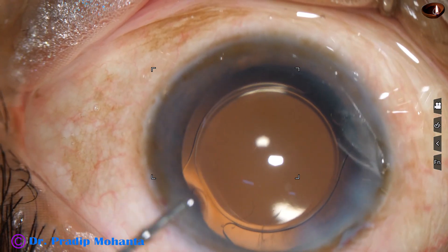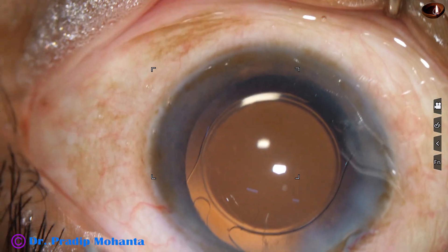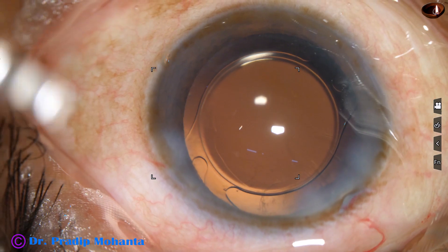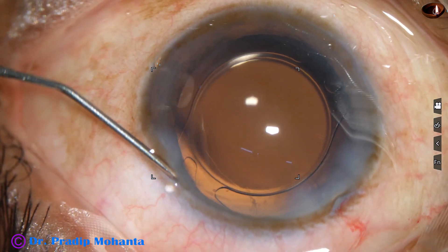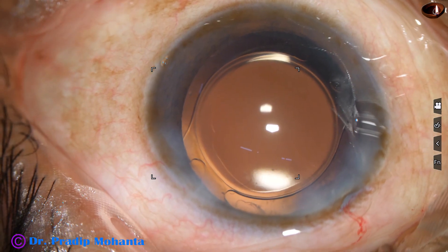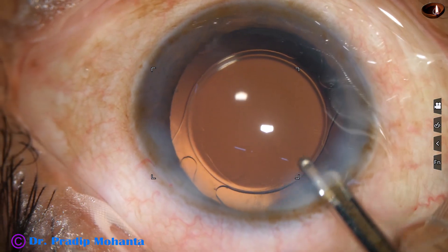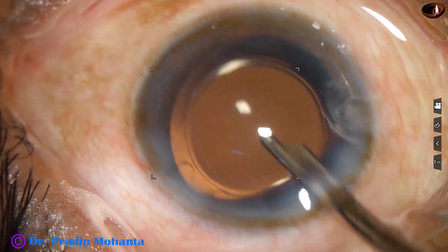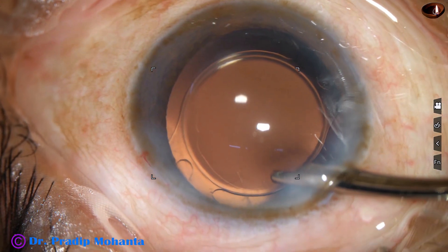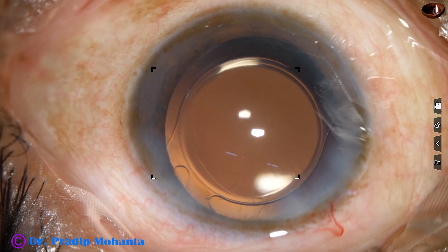A drop of moxifloxacin is applied. The side port is closed by hydrating the corneal stroma with BSS. This is the final anterior chamber lavage; the anterior chamber is formed very nicely.